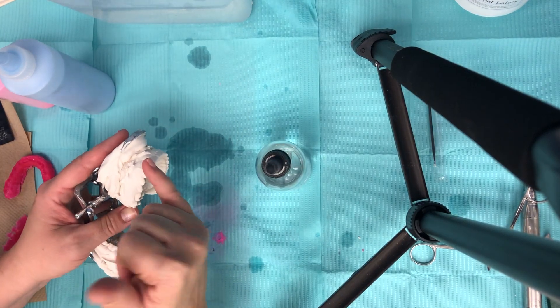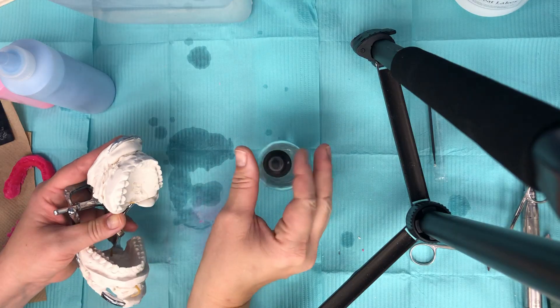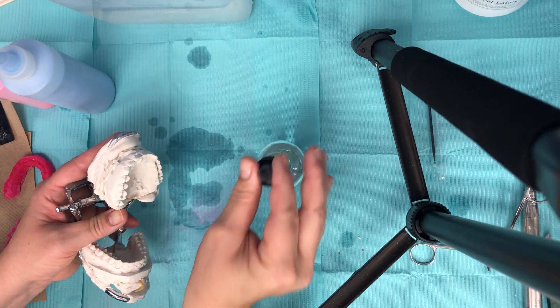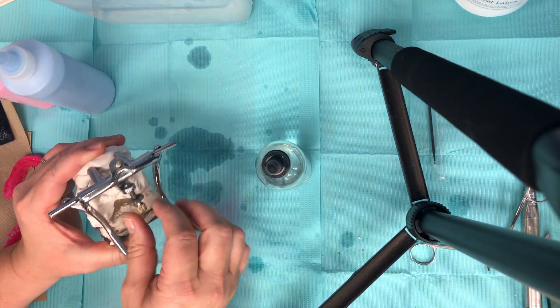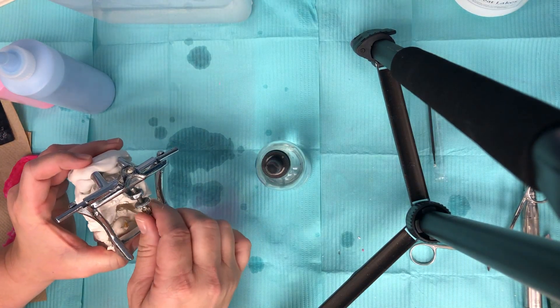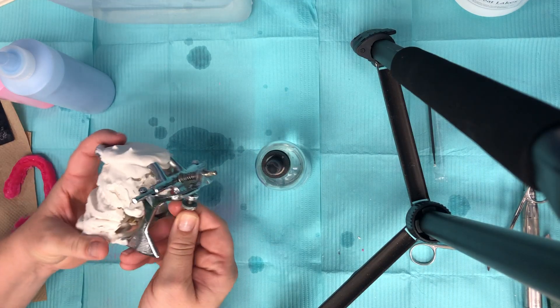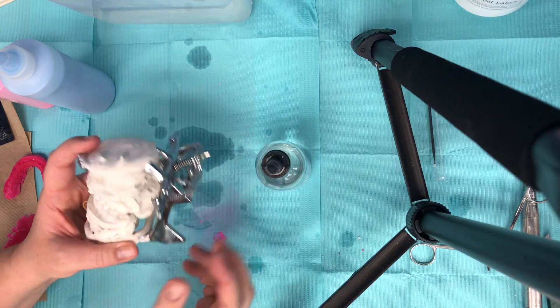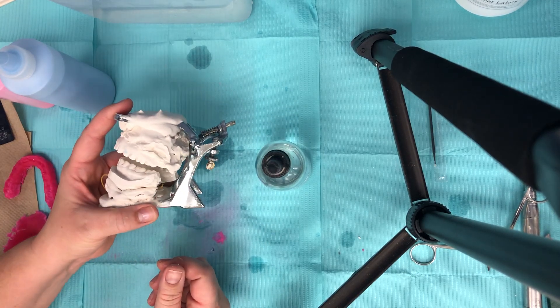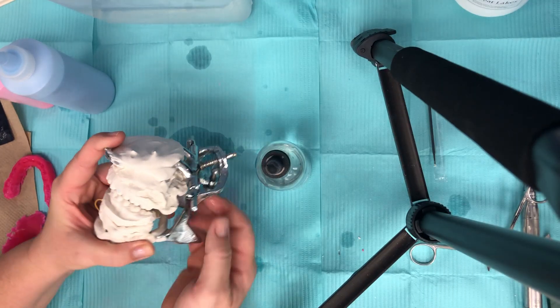We're gonna start on the patient's upper right buccal — but before I do that I want to show you the pin. We're gonna go ahead and set our pin height. If you screw this down it will actually open up the bite, and so this is going to tell us how thick we're gonna make this splint.